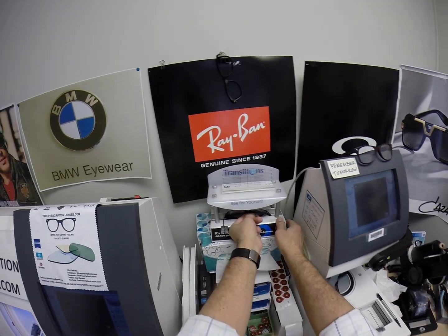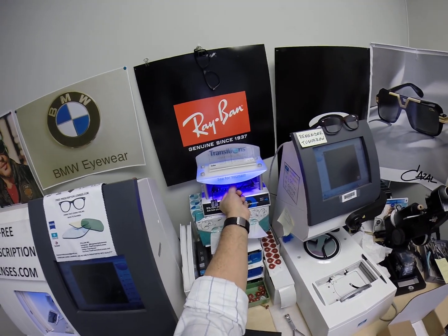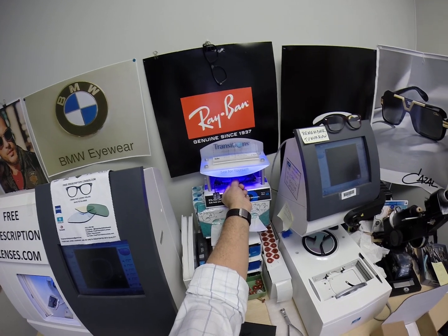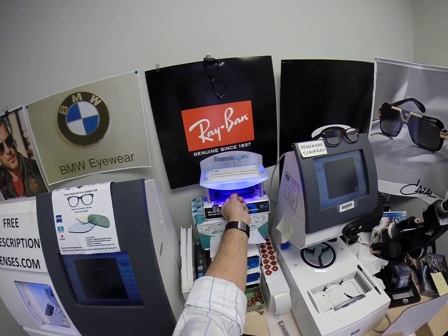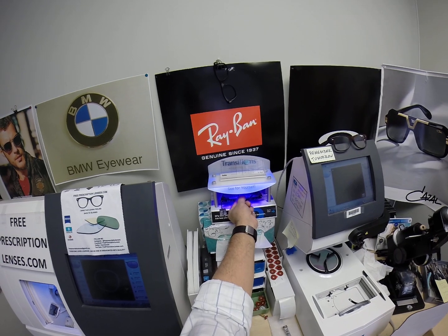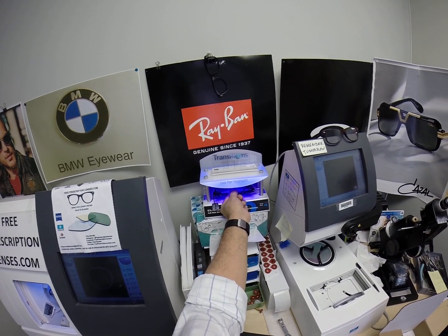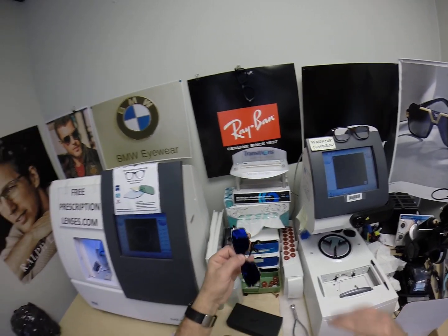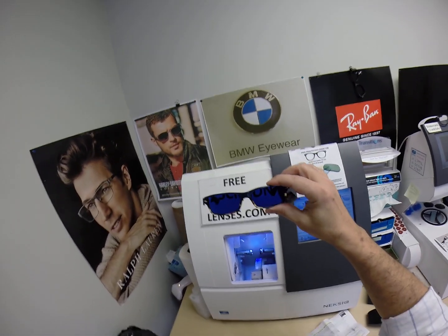I'm going to put them in a strong burst of ultraviolet light. Now, as you can see, it takes about 30 to 45 seconds for them to darken, a little bit longer when you come back inside, 45 seconds to a minute, a minute 15. The only time they won't work is when you're in your car. Your windshield absorbs the sun's harmful ultraviolet rays that would cause your dashboard to crack from sitting in the sun all day, and that's why they don't turn dark in a car.